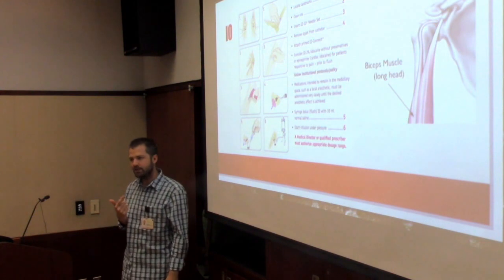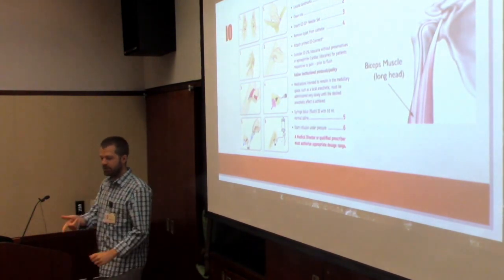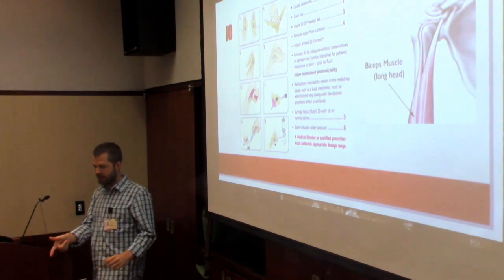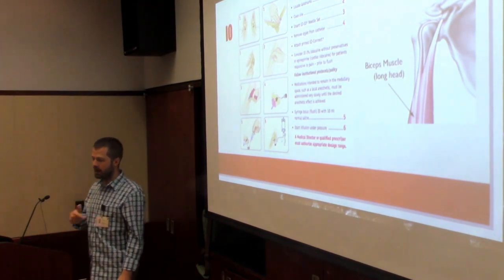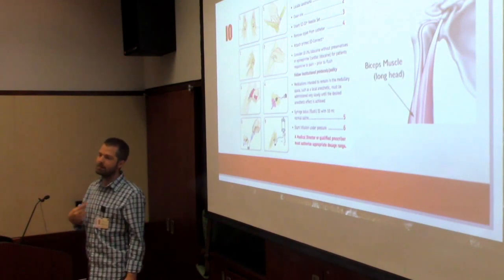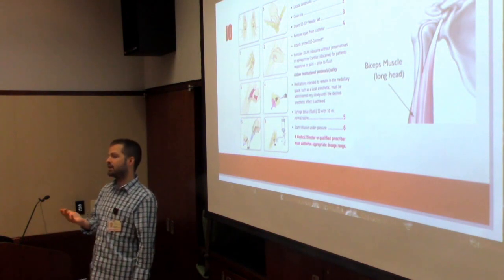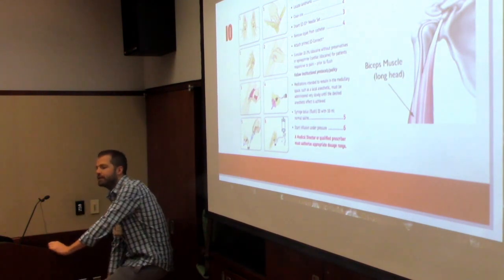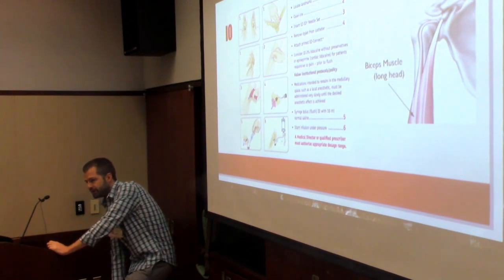But a lot of people, you don't know where you're going. And so, you stand there with the drill, you stand above their leg and you think, okay, I'm kind of aiming here, so I'm just going to go. If you ever think you're going to put an IO in, take the time and feel the person's leg. Feel the arm. And you can do this with yourself. So feel, we'll say, your left leg, just below the knee. And feel where the bone is. Find the tibia.